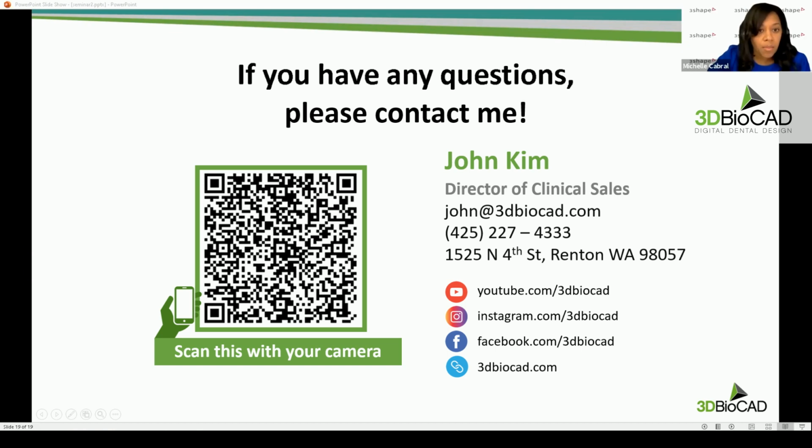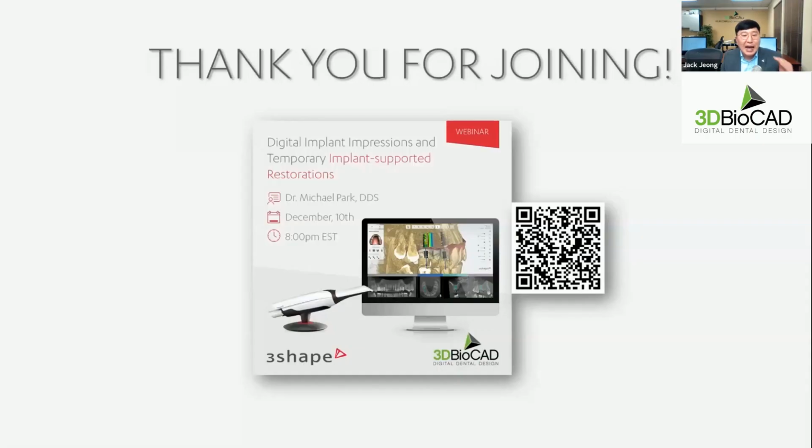Okay. What are you using for bone segmentation? Jack, do you want to answer that question? Yeah, in Implant Studio, we don't really have the bone segmentation and bone-supported surgical guide function yet. It is coming. I heard it's waiting for FDA approval, and as you know, that takes a long time. But for real cases, I do the bone segmentation in my dental system software, the laboratory software, because it has a tooth reduction function.